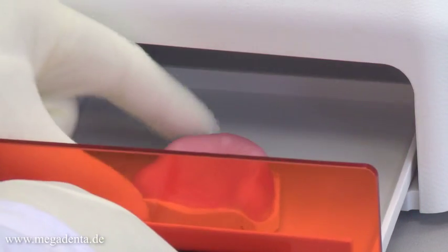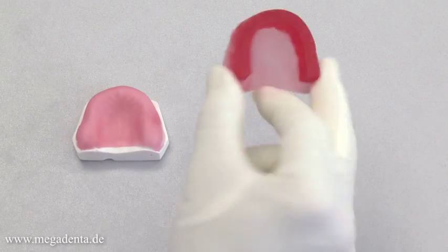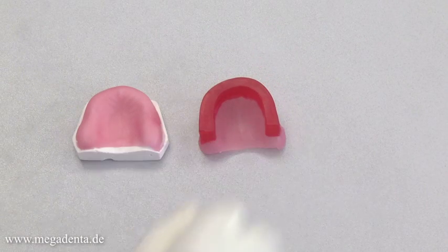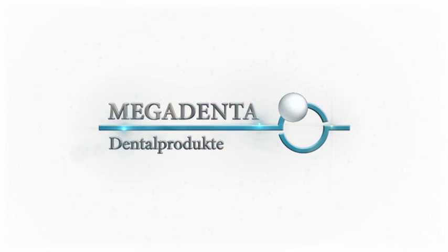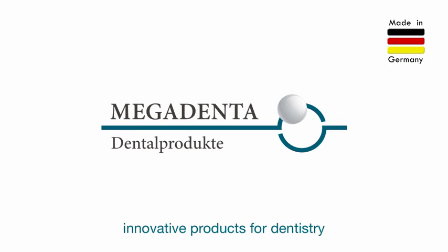The final base plate is ready for use. Megatray — the light curing tray and base plate material from Megadenta. Megadenta: innovative products for dentistry, made in Germany.